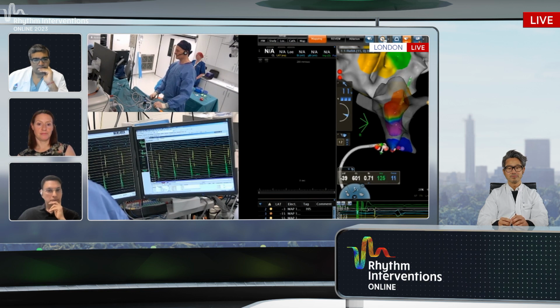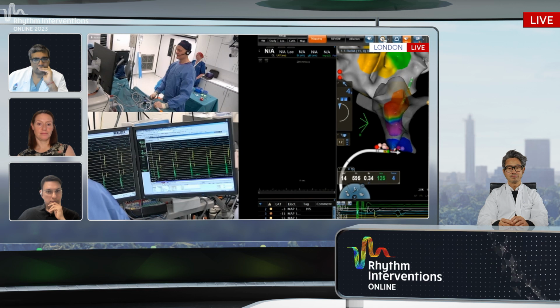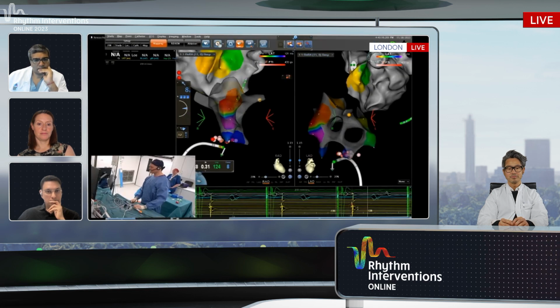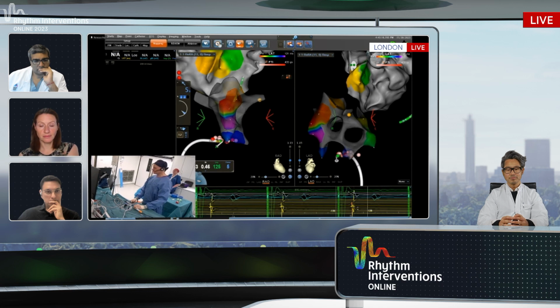And I think we've still got conduction through there. And again, you can see that phenomenon of when I've got it flat on there, mapping distal and proximal, swapping positions there with that very long signal on the map 3/4. Can you see that sort of really fractionated long signal there?